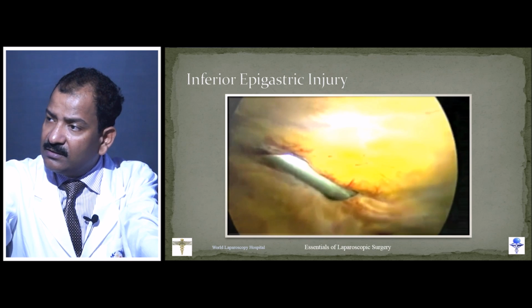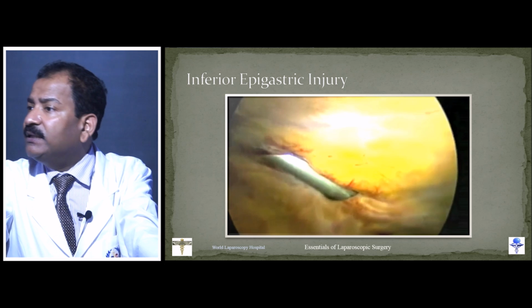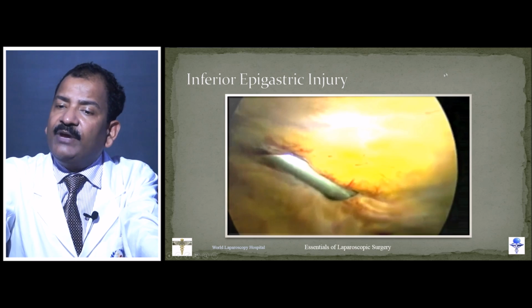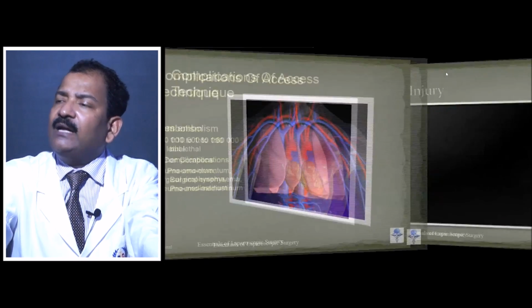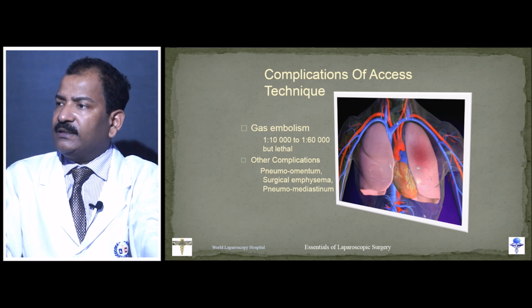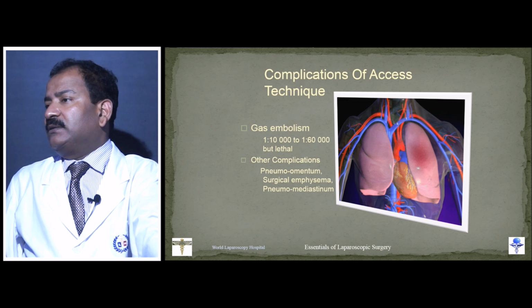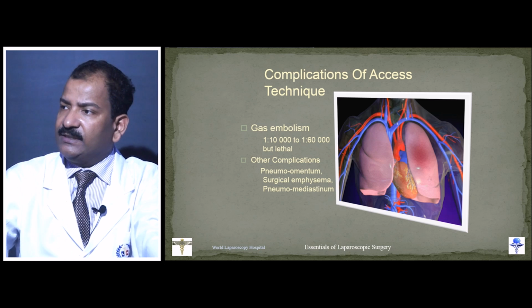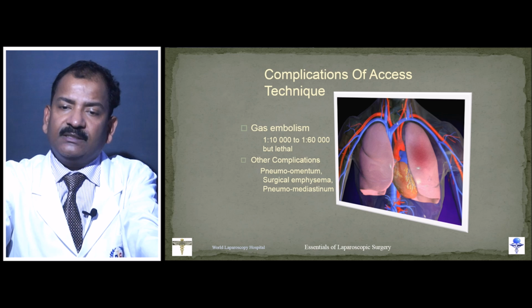Pardon? This? Okay, figure of 8, no, figure of 8 you can make, but generally it should be one cross over another and interrupted. It is all interrupted, you cannot do continuous with the suture passer.